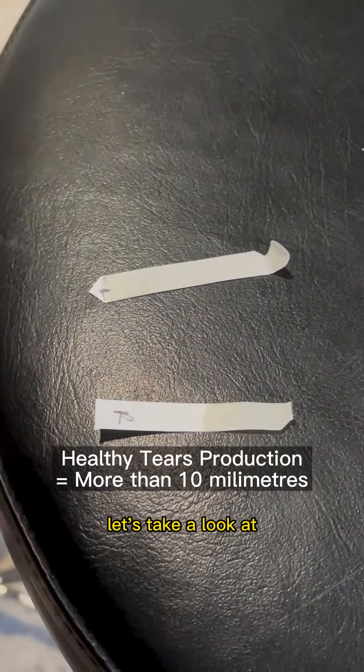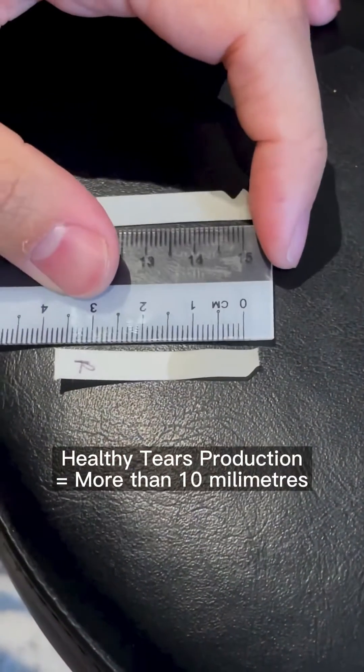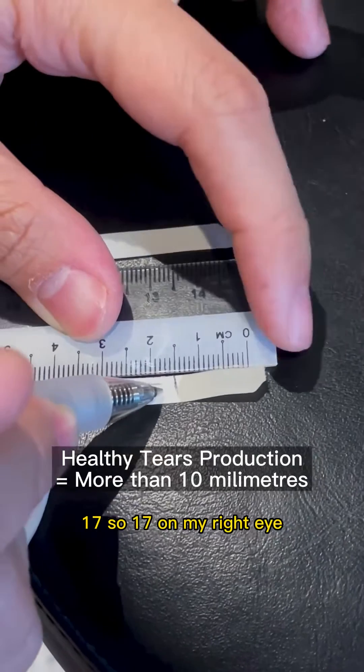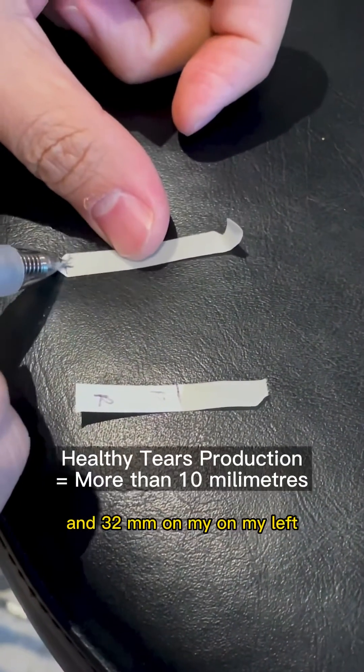Let's take a look at this side — the right eye. More than 10! I have no dry eyes. This is about 17. So 17 on my right eye and 32 on my left.